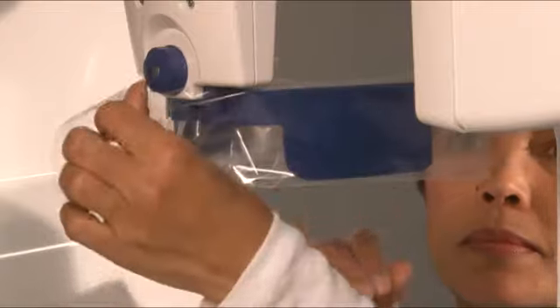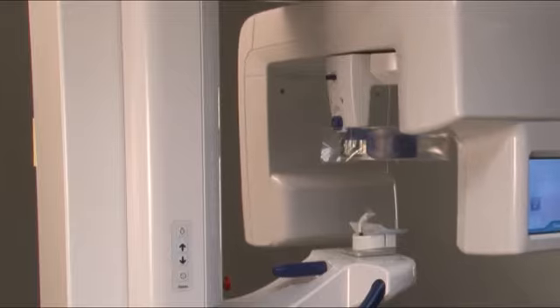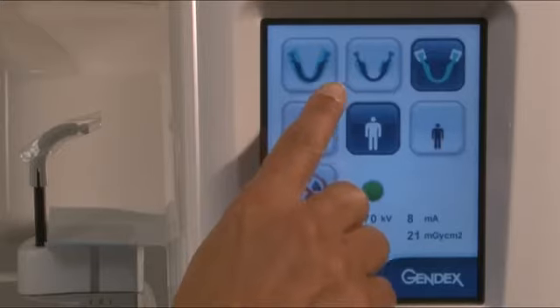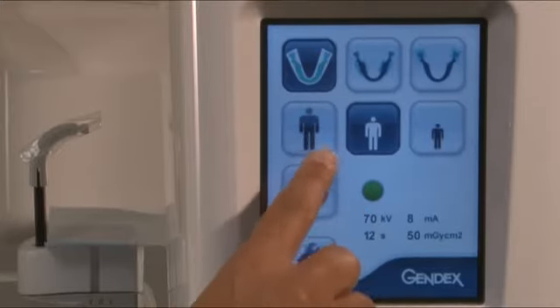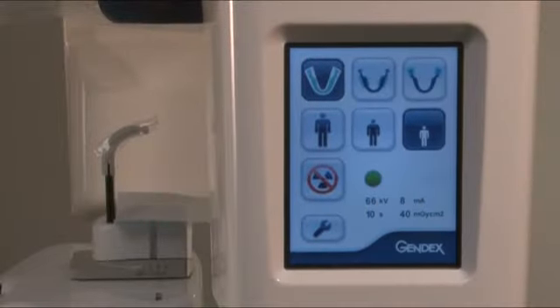Fully open the head supports. Place barriers on the head supports. Next, press the reset button to position the rotating unit for the patient. Select the projection and patient size. Note, if small panoramic is selected, the width of the image is reduced.